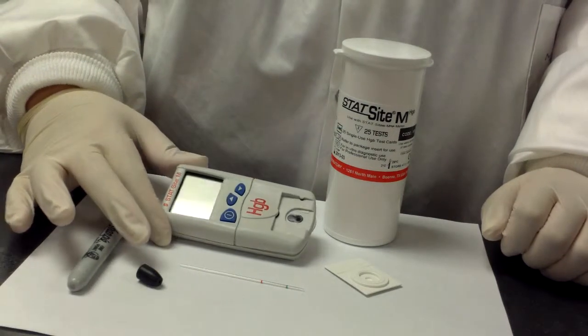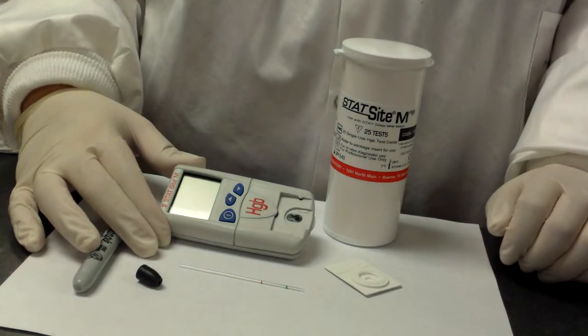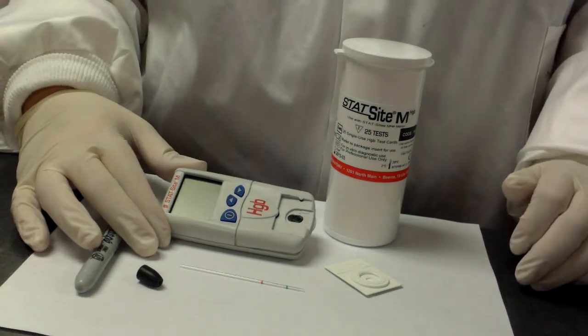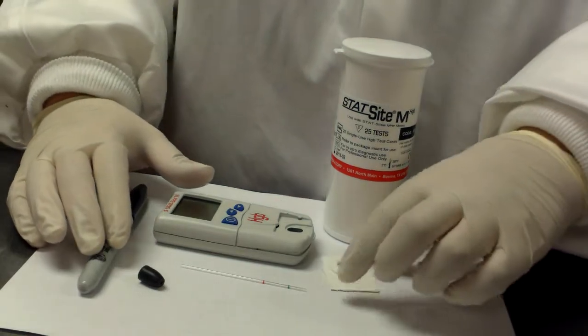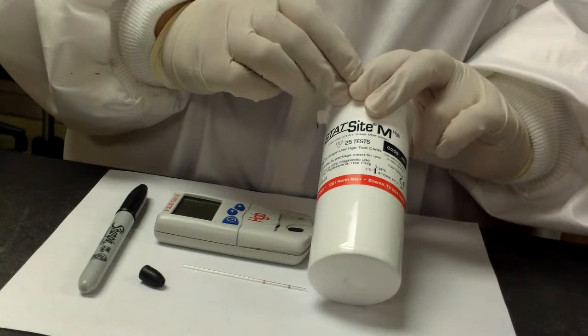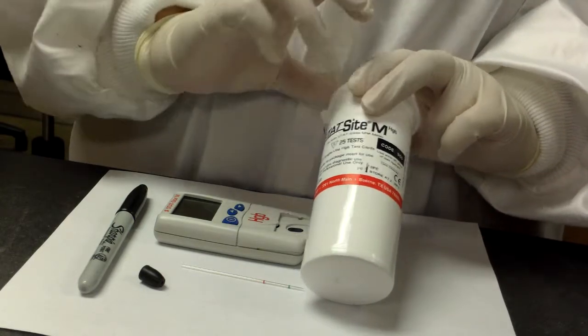This is a StatSite hemoglobinometer. It's just another point of care testing machine. This particular one does just hemoglobins. It comes with a cartridge that we're going to use, and they need to stay in the can until you're ready to use them so that they stay dry.